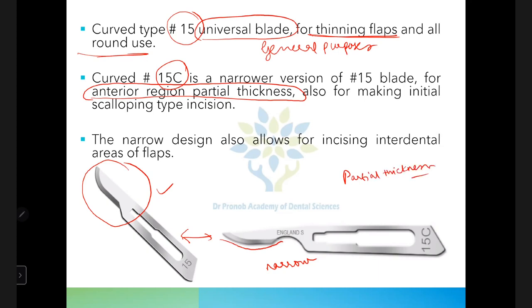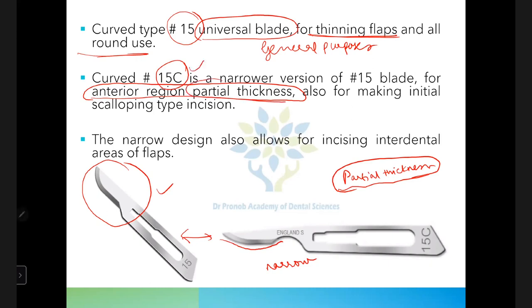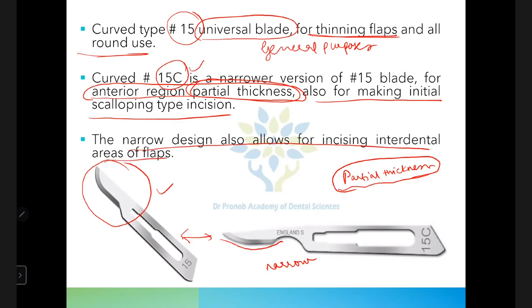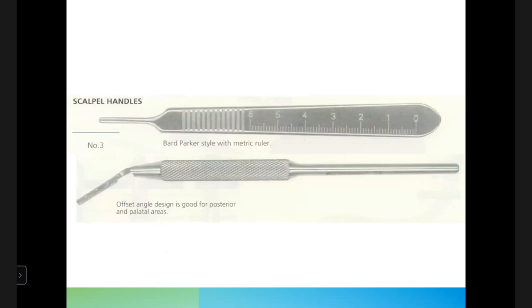In partial thickness flap surgery, the bone is not exposed, whereas in full thickness flaps the bone is completely exposed. Blade 15C is used for partial thickness flaps and for making initial incisions. Its narrow design allows incising interdental areas of flaps.